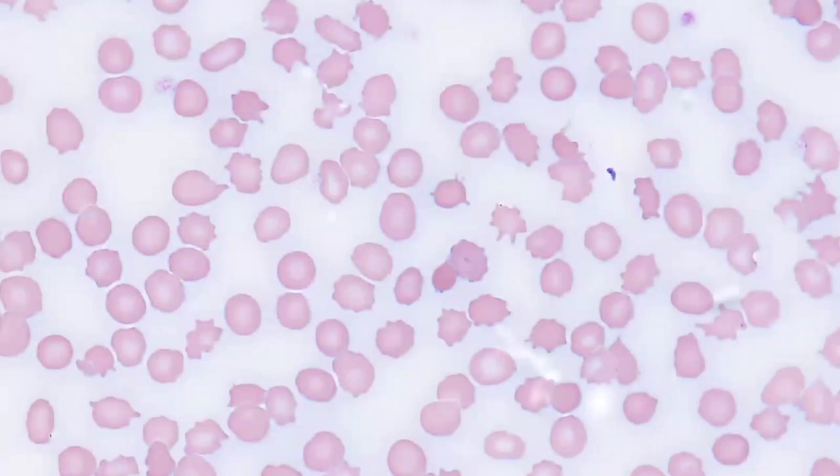However, clinical conditions associated with the presence of true echinocytes in peripheral blood include severe renal disease associated with uremia, liver disease, vitamin E deficiency, pyruvate kinase deficiency, burns, heparin therapy, and gastrointestinal disorders. In this specific case, the patient has end-stage liver disease as well as an acute kidney injury.